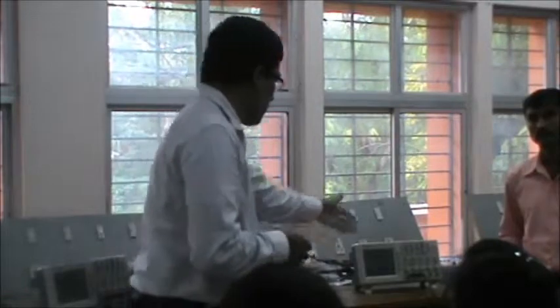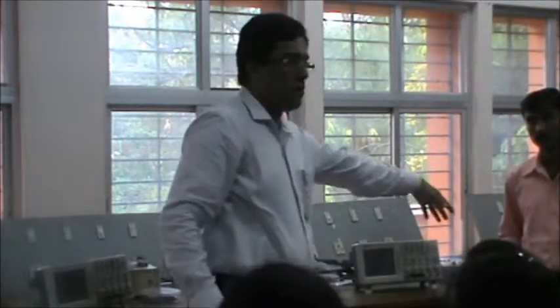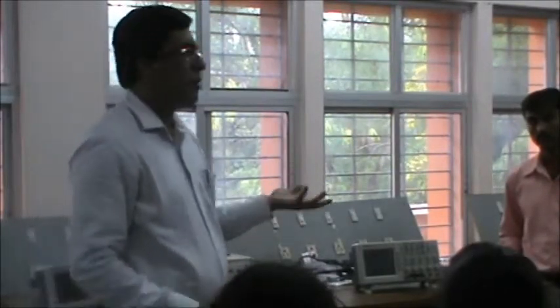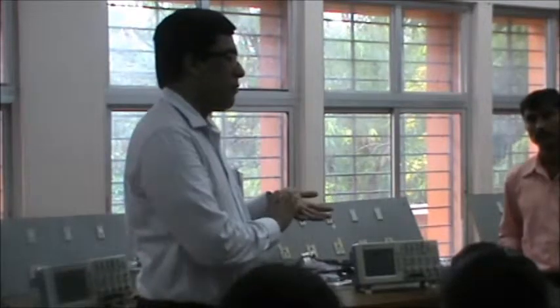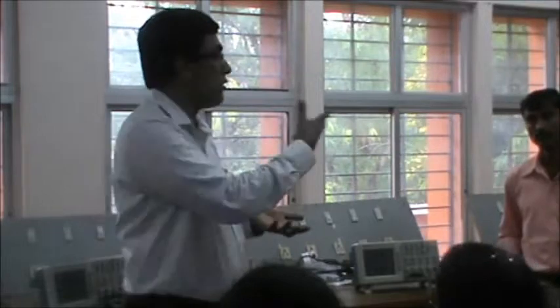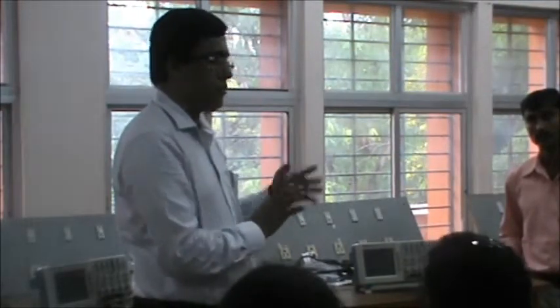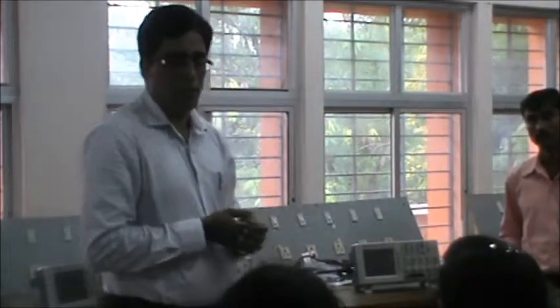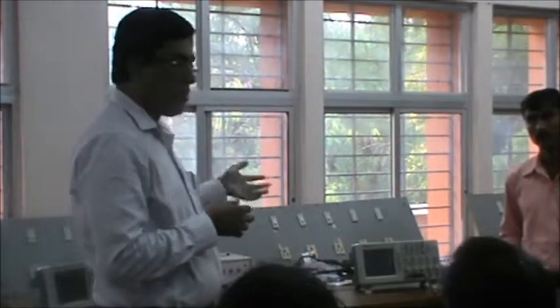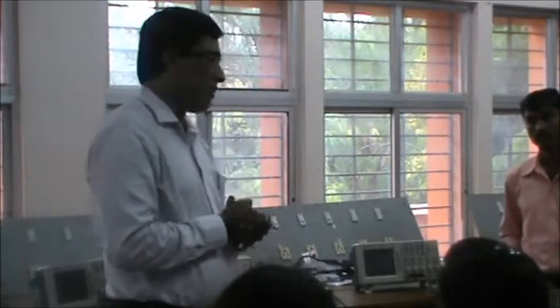So you see this is very safe. The signals are transmitted and this can be sent anywhere. Normally you have various gadgets which are able to capture this, like mobile devices, which can send it to an Android platform, or any other device, to a doctor sitting at home. A lot of advancements are happening on the communication side of any of these medical devices.